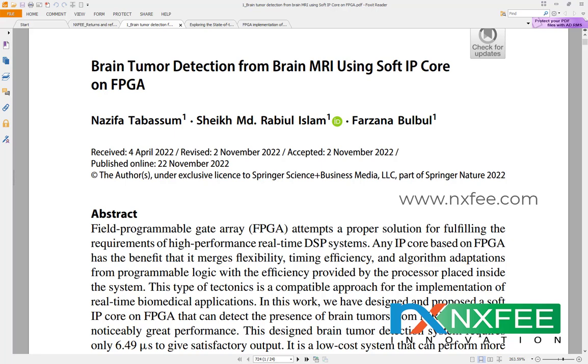The edge detection results are used to segment and highlight abnormal regions, and a thresholding mechanism is employed to differentiate between normal and abnormal images. Hardware resource utilization, including lookup tables, flip-flops and power consumption, is analyzed after synthesis to verify system efficiency. The experimental results confirm that the proposed FPGA implementation provides real-time processing and reliable brain tumor detection with low power usage, making it suitable for portable and embedded medical devices. The stride 1 approach guaranteed maximum detection accuracy and detailed edge preservation in all test cases.